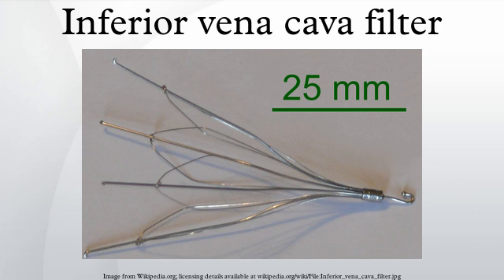In patients who have been treated with a weakly ferromagnetic IVC filter, it is advised that the patient wait at least 6 weeks before undergoing an MR examination, unless there is a strong clinical indication to perform the MR examination sooner after implantation, and as long as there is no reason to suspect that the device is not positioned properly or that it is not firmly in place. Most studies of IVC filters have generally been conducted at 1.5 Tesla or less, although many IVC filters have now been evaluated at 3 Tesla and deemed acceptable for MR examination.